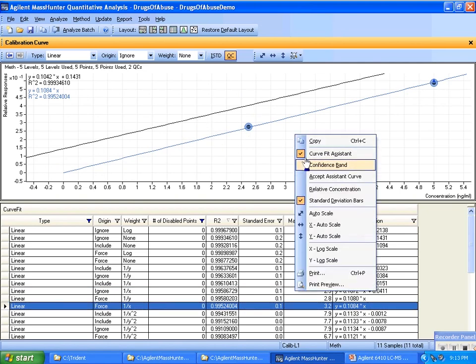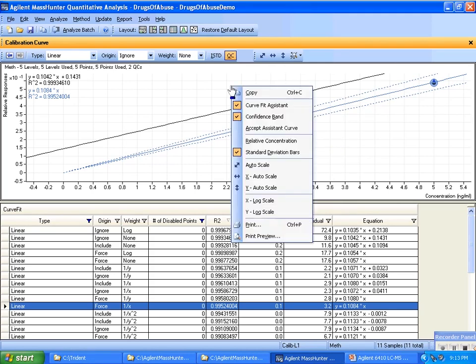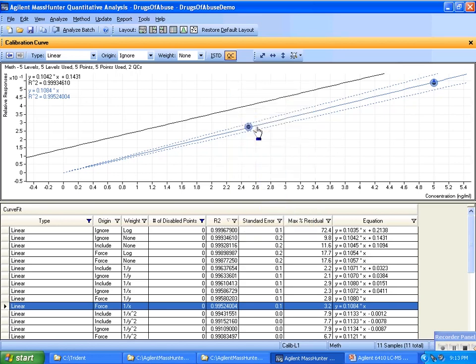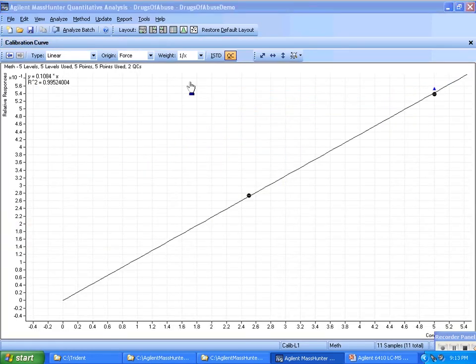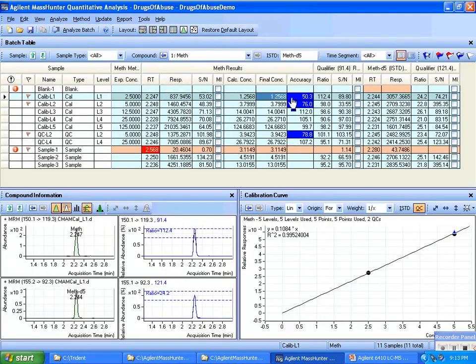And what I'll do is I'll show you the confidence band across this, and you can see with that confidence band, those points are right within that line. So what I'm going to decide to do here is I will accept this proposed curve, and the calculations will now be done with the weighting, and I'll go back to batch at a glance, look at my accuracies, reanalyze, and you'll notice that the accuracies now are all falling into place very nicely.